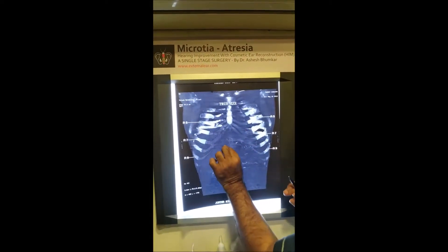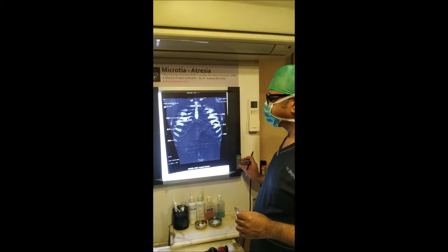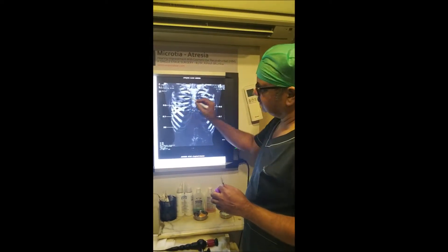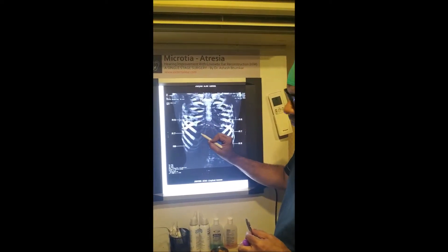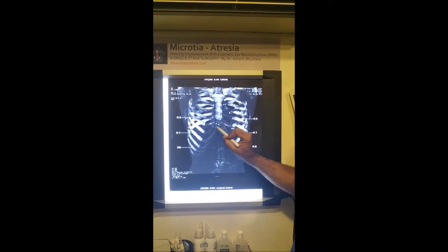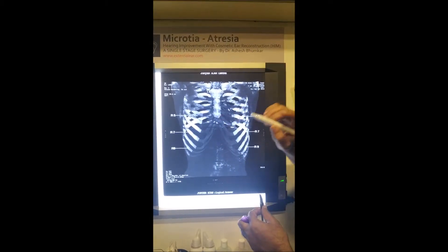This planning helps us modify the framework and adapt it to the specific conditions of the patient. This is a true-size CT scan of the child's rib — the bright white is bone and this is the cartilage. The majority of the chest is made of bone; the cartilage is only in the front, so when you take it, you do not cause any harm to the chest.